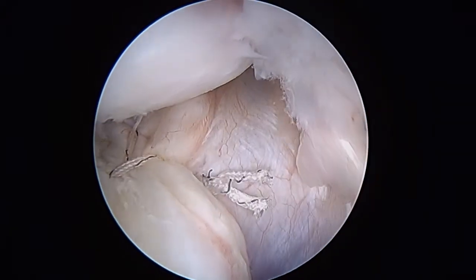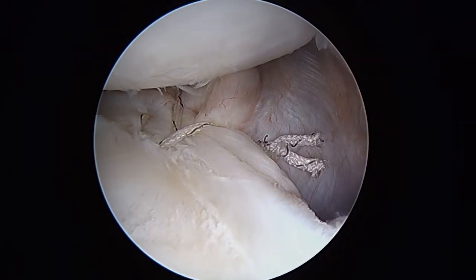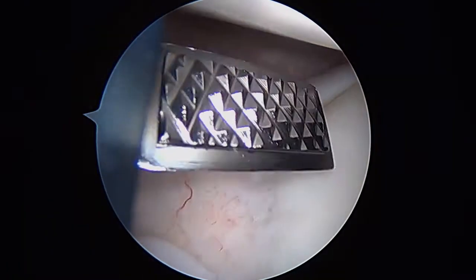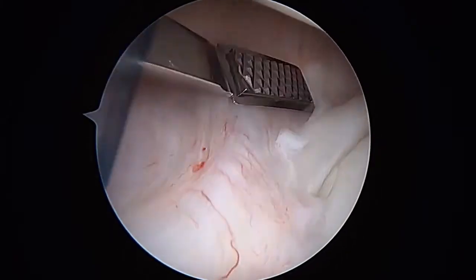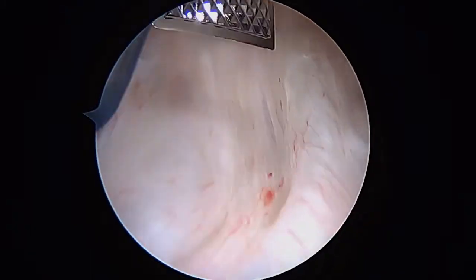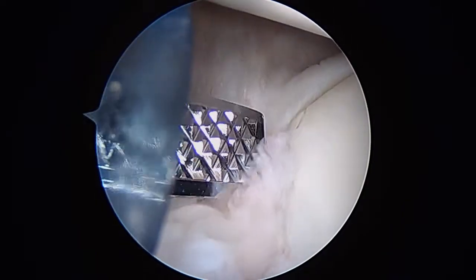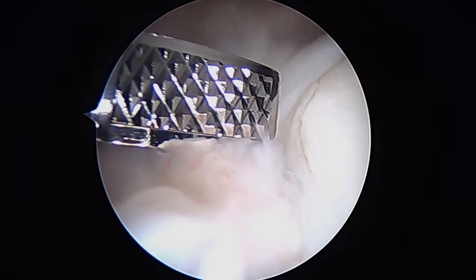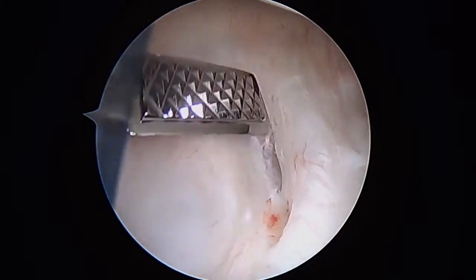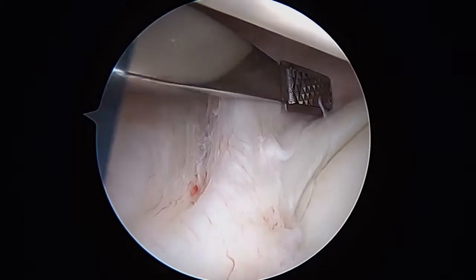So once we tie that suture, it ends up looking like that. I'm happy with the way that looks. We're going to go ahead and get to working the front of the shoulder next. Here we are looking down the front of the shoulder, and we're using this instrument once again just to rasp or roughen up this anterior capsule. We're going to use our anchors here because you can see there's been some traction on the cartilage — see how it's cracked there? We want to have a really solid anchor point, so we're going to use these little 1.3 millimeter all-suture anchors to tighten up this part of the shoulder.